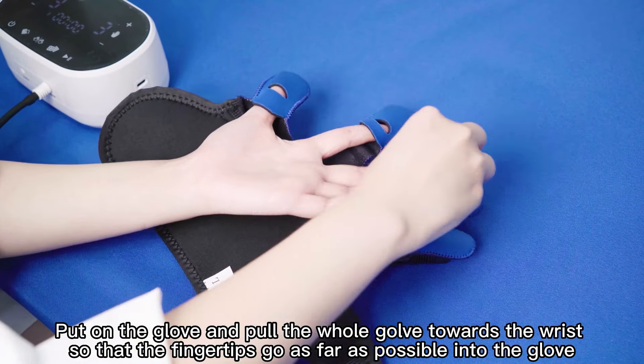Press the menu button to select passive mode. Select the extension and flexion index. To train for the first time, the recommended extension index is set to 8 and the flexion index set to 3. Press the start button to begin training.